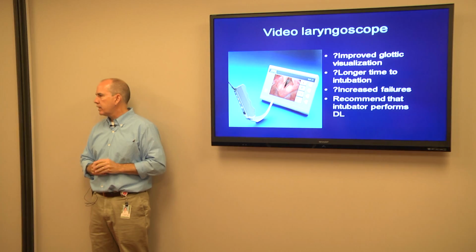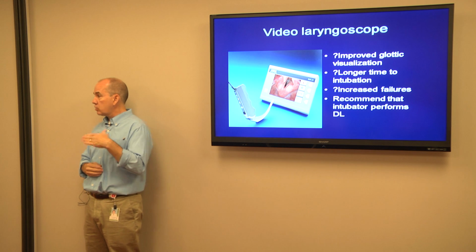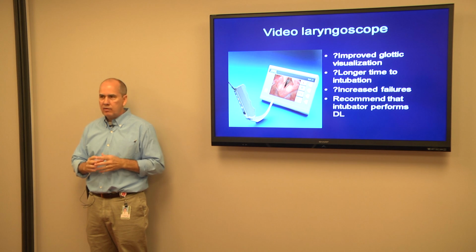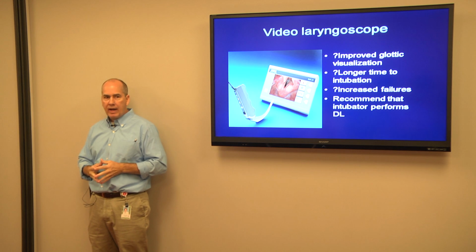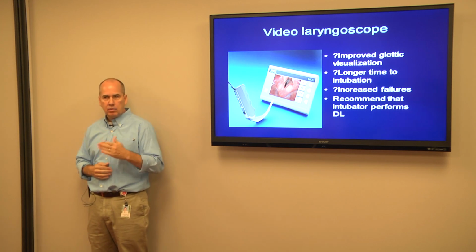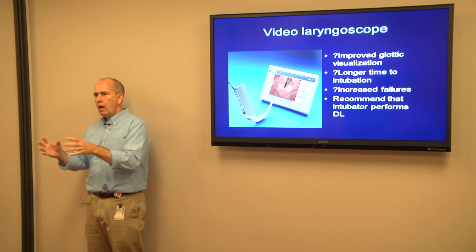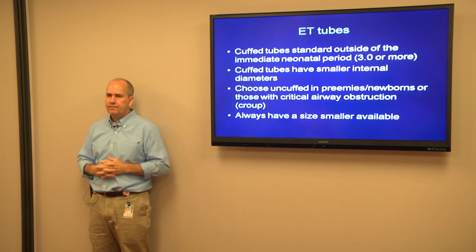The other thing is it's changed how they recommend you intubate. Anyone learn to put it in and pull back till you find it? Now the catch term is progressive identification of the structures. You need to start identifying every structure as you're going in. In some teaching spaces in the literature, you're asked to call out the structures you're identifying. As a learning intubator, you call out tongue, epiglottis, and so on. So it's progressive identification of the structures rather than going all the way in and pulling back. Does that make sense? It's really changed that perspective.